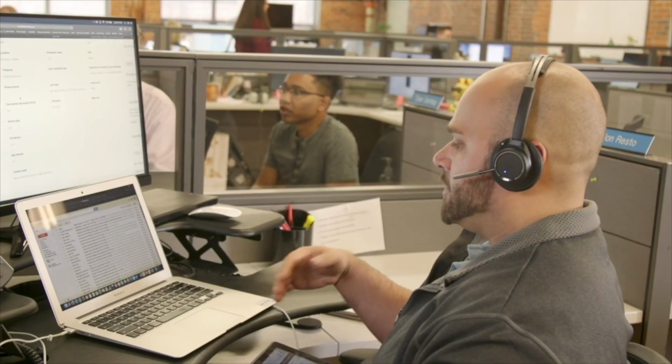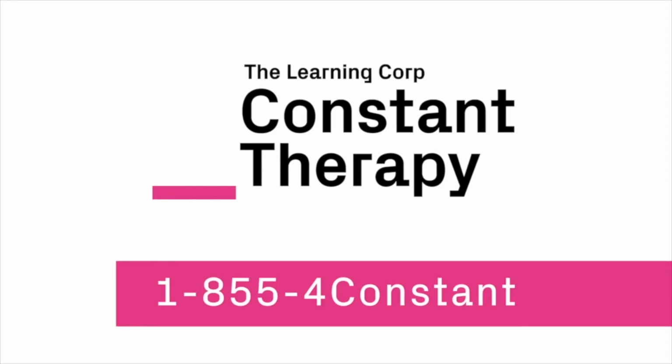Finally, Constant Therapy has a fantastic support team for you and your clients. Your clients can always have someone to contact between sessions and after discharge.